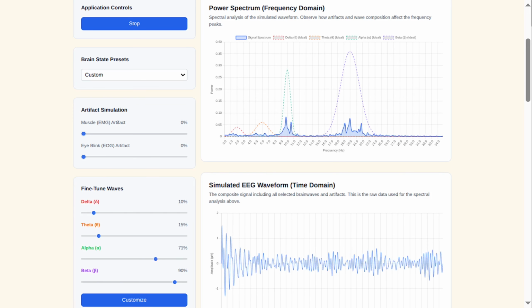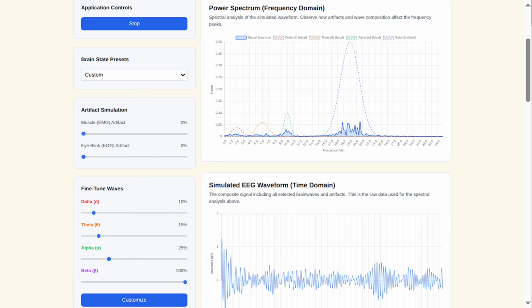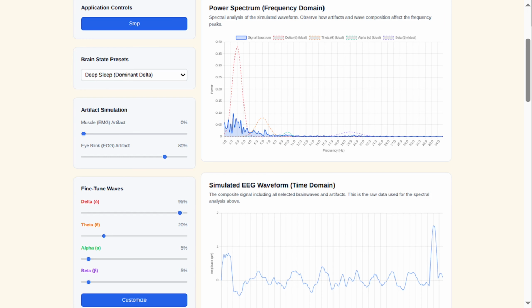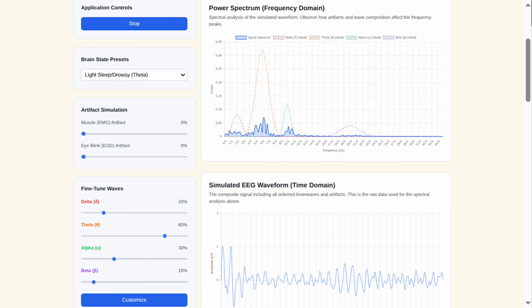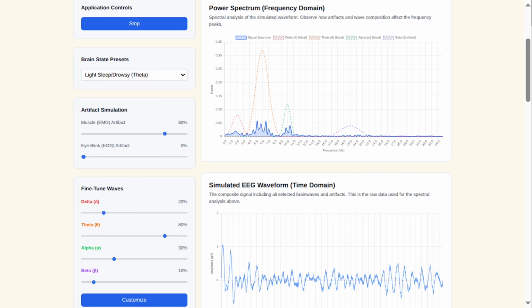Okay, so can you tell me one sentence about recording brain waves, EEG, and what the EEG stands for? EEG stands for Electroencephalography, and it records brain waves by detecting electrical activity in the brain through sensors on the scalp. So is it magnetic or electric? EEG measures electrical activity, not magnetic. It picks up tiny electrical signals from the brain's neurons firing.